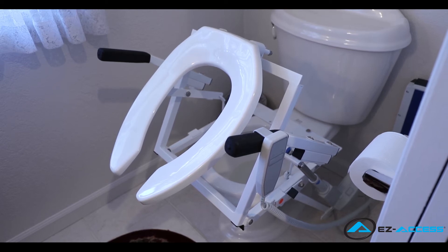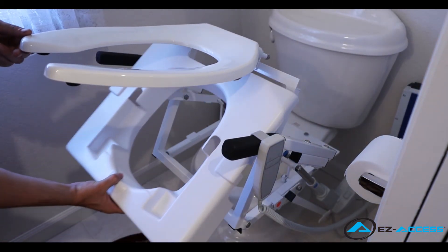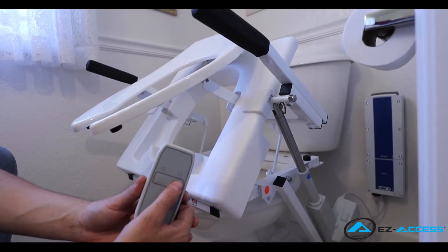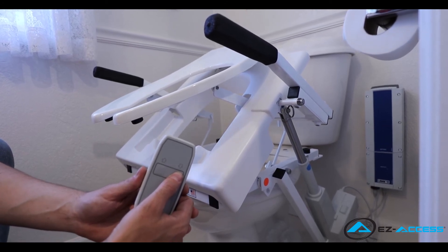Once the shield has been cleaned, you can reinstall it by placing it forward then downward in place on the frame. Using the handheld control, lower the tilt into its down position and it's ready to be used.